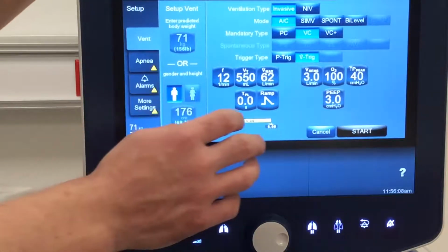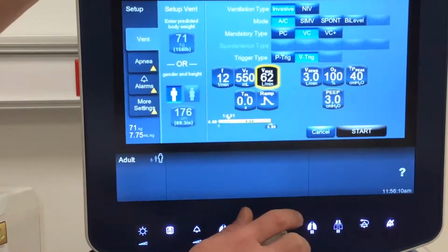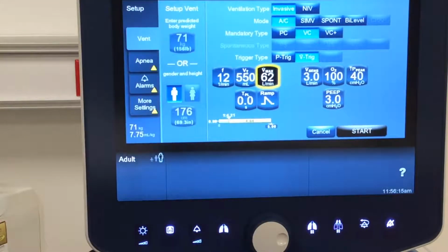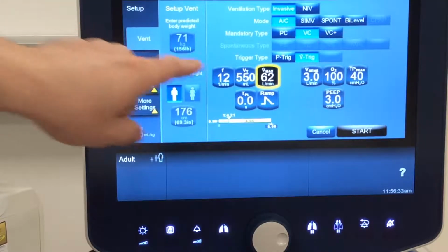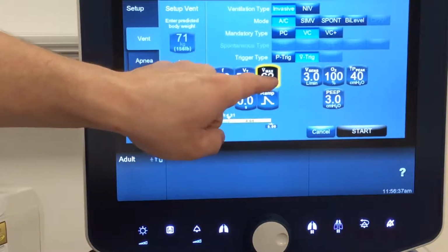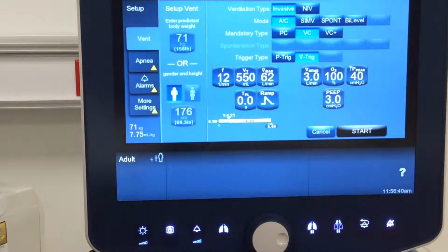This next setting is something that on your sheet, it wants you to give 60 liters a minute. Well, let's talk about what this is. So Vmax on this ventilator is something called inspiratory flow, peak flow. It's the speed at which the ventilator is delivering that inspiratory flow to the patient. One notable thing about volume that makes it a bad thing is that peak inspiratory flow is fixed, meaning not only is that patient going to get a set tidal volume, but the speed at which they're getting that air to achieve that volume delivery is also fixed.